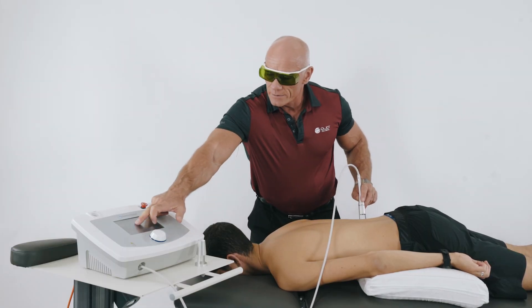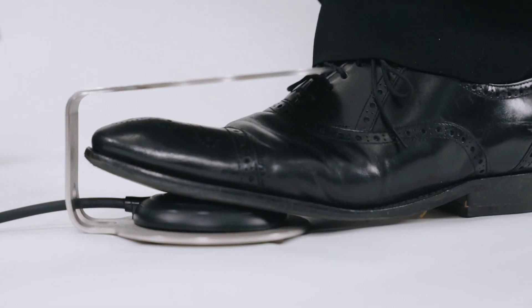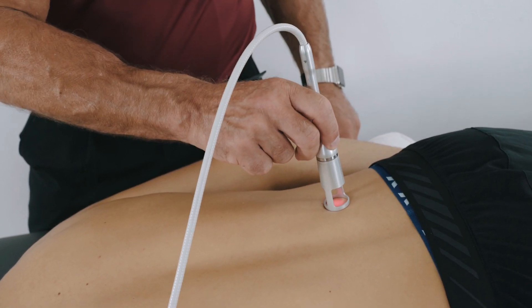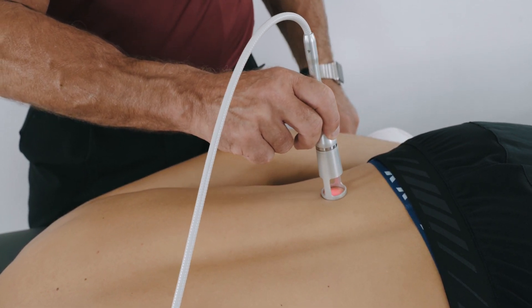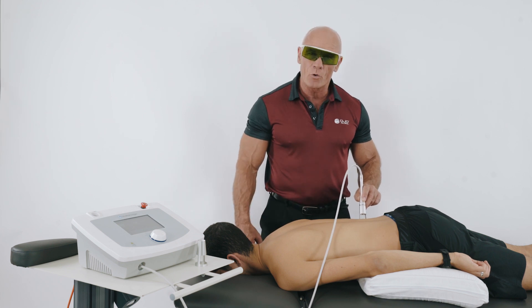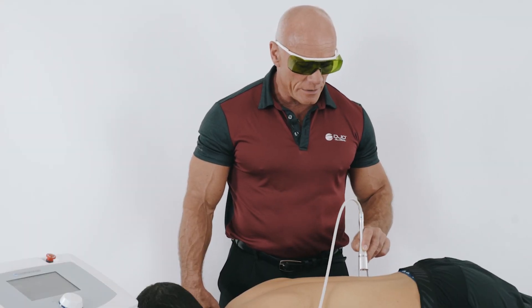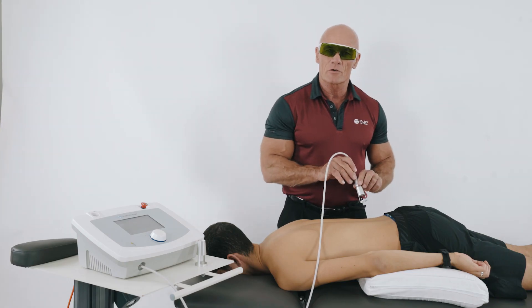I press play on the screen and then I press the foot switch. These are built-in safety features. You'll note that I'm now using a spiral technique. It doesn't matter whether you go from the centre out or indeed from the outside into the centre. Once you reach the centre, just pause for two to three seconds and then repeat the spiral motion until phase one has finished.